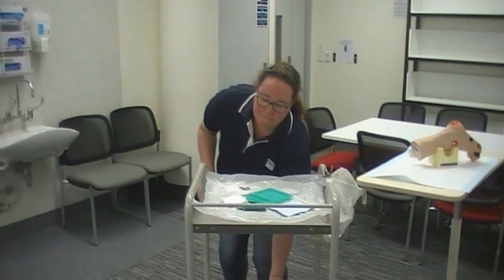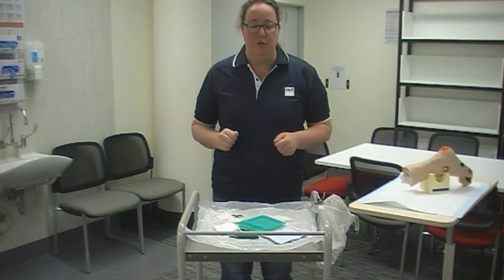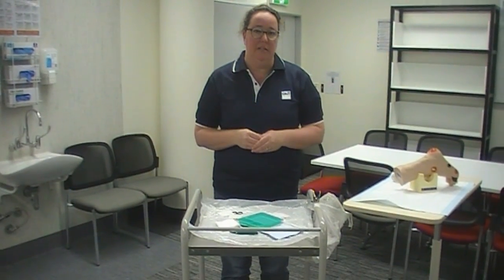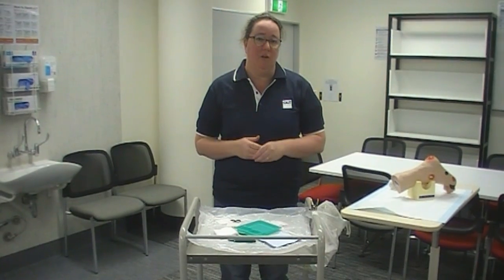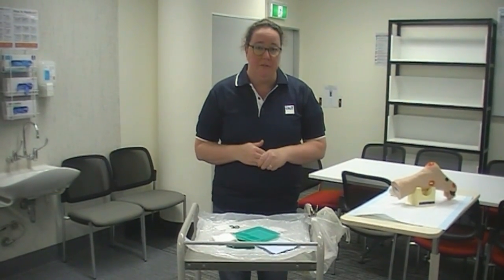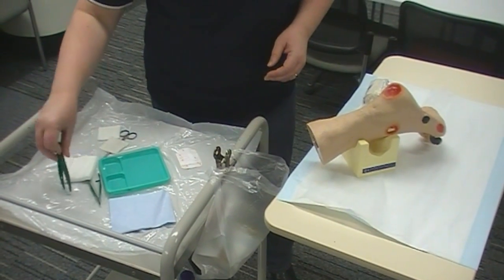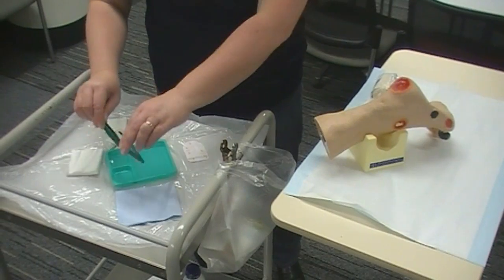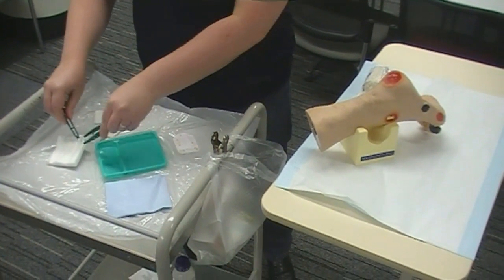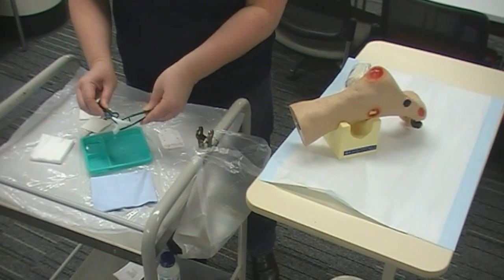Once everything's set up and my patient is ready, I'm going to go and do a good two-minute hand wash before I come back and use clean hand technique — or you can use gloves depending on the facility policy or even the wound requirements. So once I've washed my hands, I very carefully pick up my forceps and I actually prep all of my equipment first. Not everybody does this, it's totally individual — it's up to you.